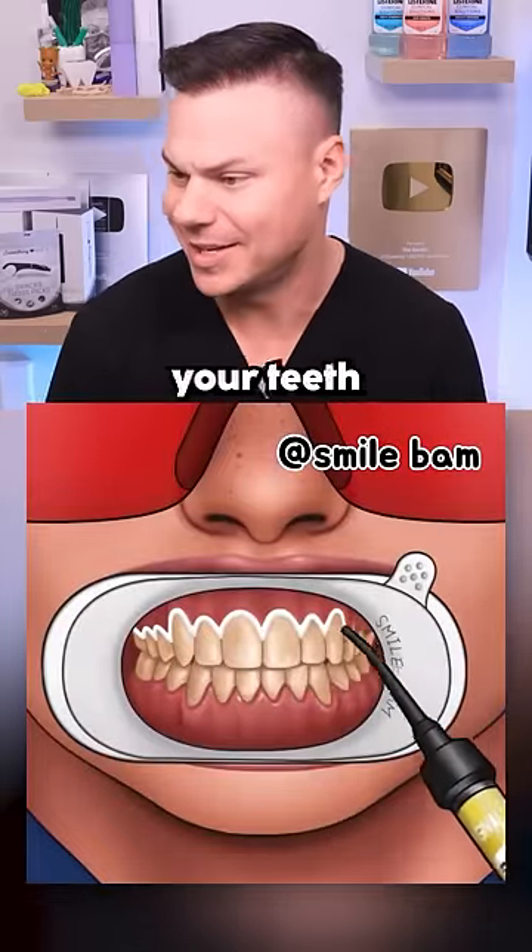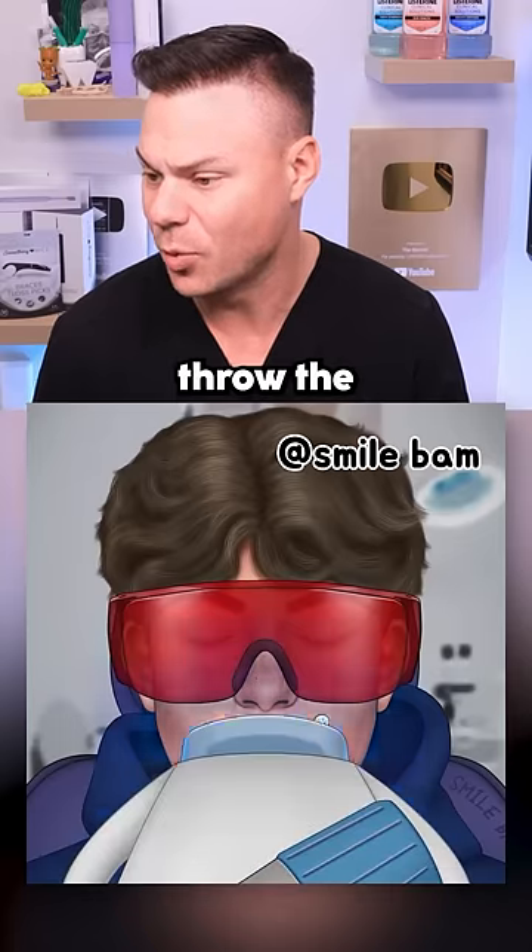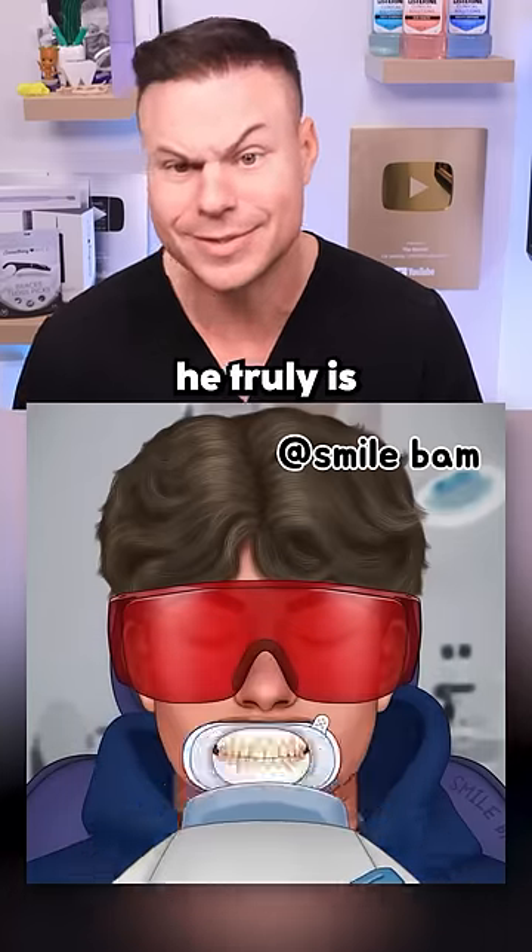Of course, you've got to whiten your teeth at the end. They put the little protective gel on there, throw the whitening on, and now he truly is good to go.